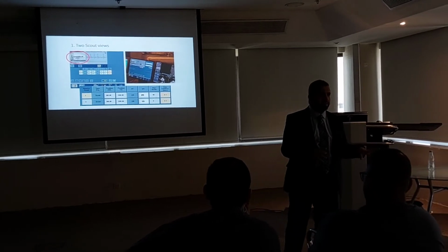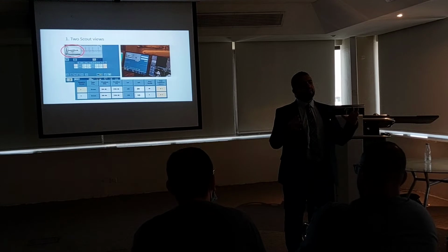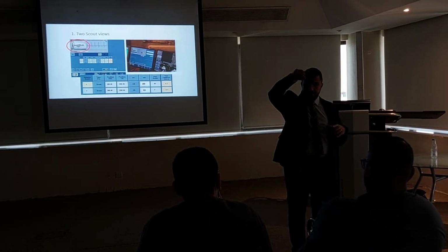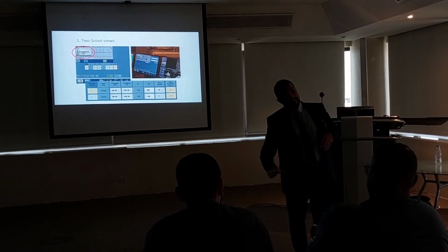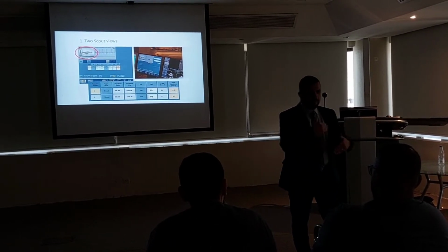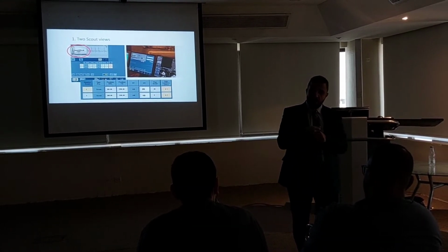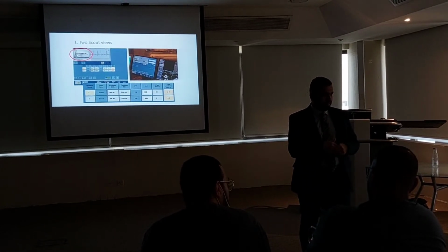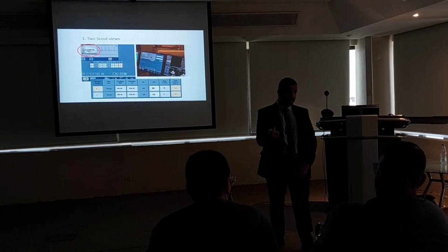Now, I will ask the patient: take a breath, hold. At the beginning, the moment he is taking a breath, the heart rate will go a little bit up, and then it will start to go down until it reaches the minimum. So by practicing this, I will find out when it is the time to scan. Okay? So that's why they prefer to use the manual. But there is a good way to do it.